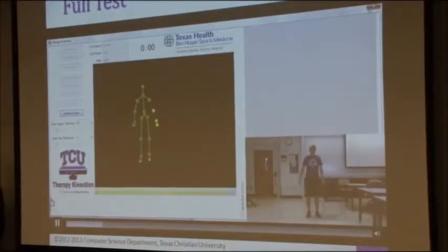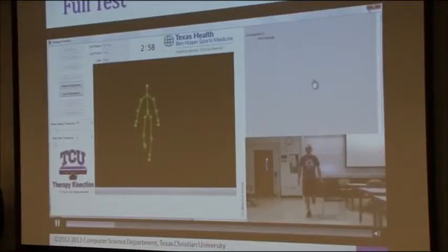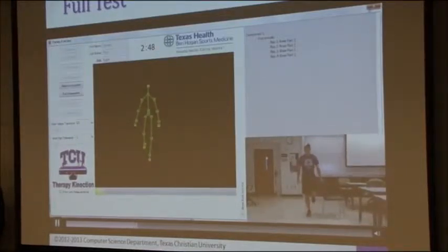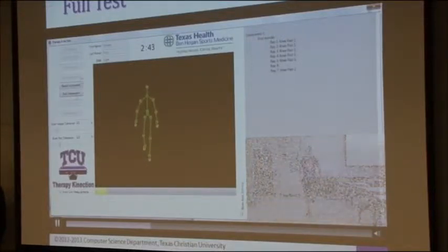So now Scott is ready to begin, and we're going to hit Start Component. And then he's executing the test. So as he goes down, you're going to see each repetition here, as well as what errors he's making. So right now we're seeing a lot of knee pass toe. So one of the ways we fix this is we can increase the tolerance, because our tolerance was too strict when he first started, and then you see it fixes the issue there.